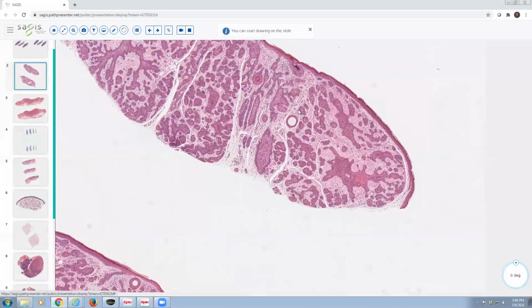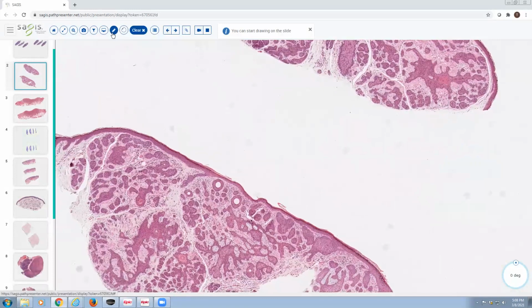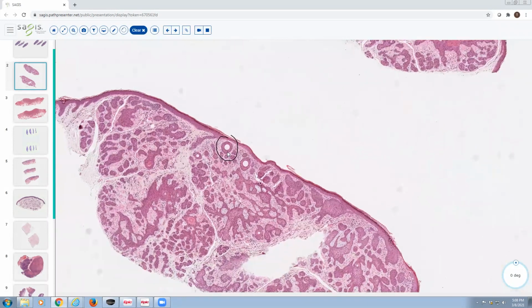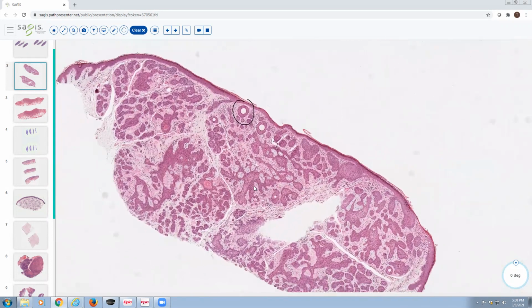So in an infundibulocystic basal cell carcinoma, you have follicular cysts within the tumor. Okay, and they're described as infundibular because they resemble the infundibulum of a hair follicle. So infundibulocystic basal cell carcinoma has cystic structures, which are derived from the infundibulum of a hair follicle.